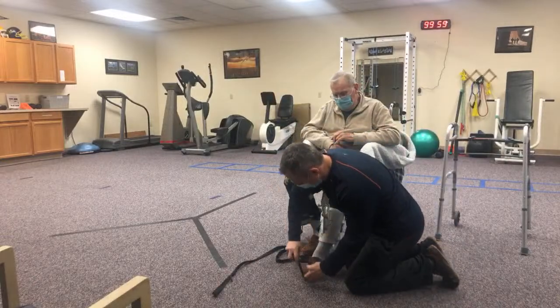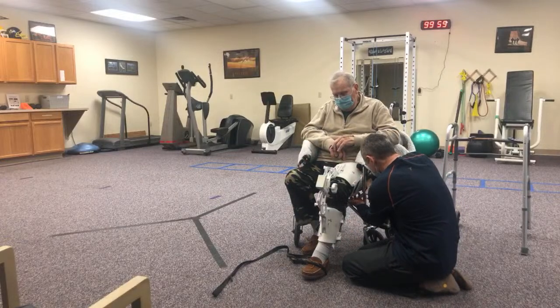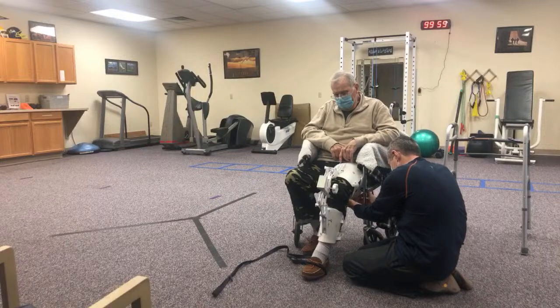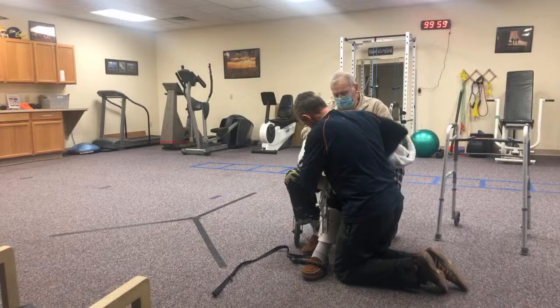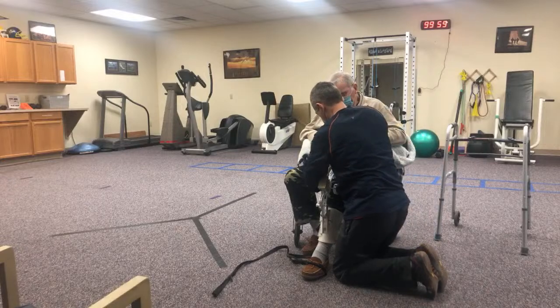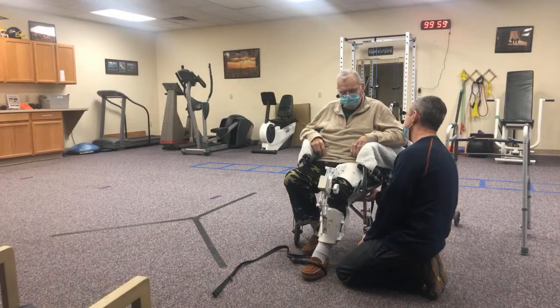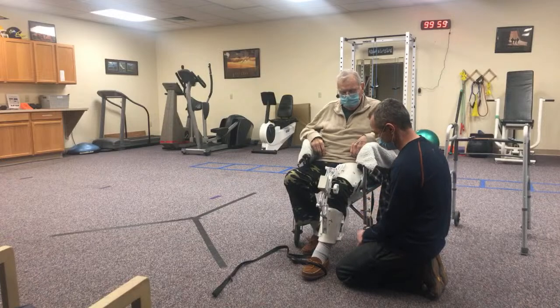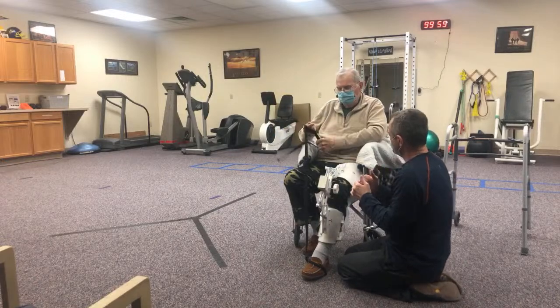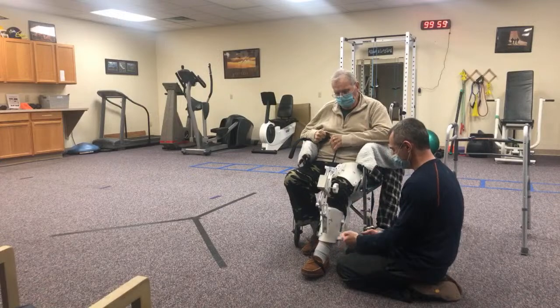Let me see - I want to put this loop under your foot and figure out a way to get this positioned so it's not pushing into the back of the knee. Now what I'm going to ask you to do - you can loop that over, hold it however you want - use that to give it a little bit of pull back toward you. Let's see if we can slide that foot in a little bit more.